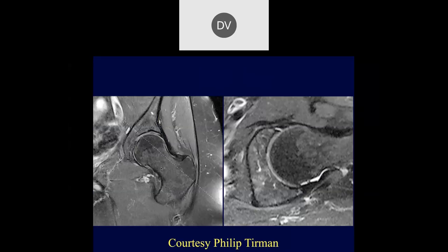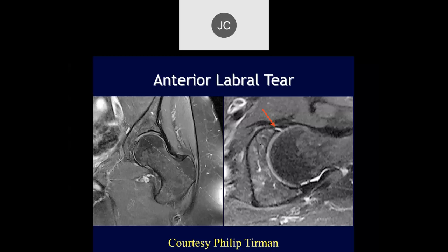Danny — at the superior-anterior labrum there's a little bit of fluid right in the labrum, suspicious for a tear. The posterior looks okay. This was arthroscoped and confirmed as a tear. It's in a slightly different configuration — the fluid appears to go through the labrum itself rather than between the bone or cartilage and the labrum, which makes it a little more likely to represent an actual tear.